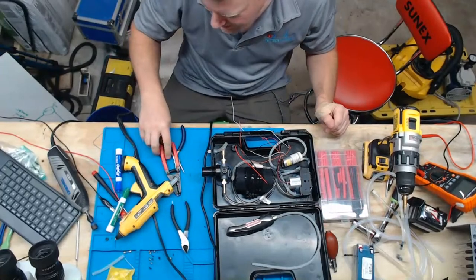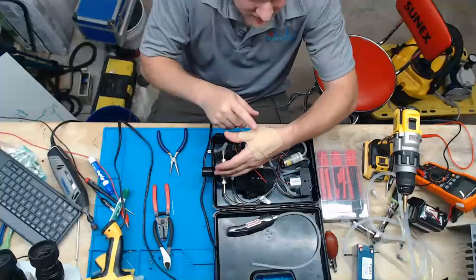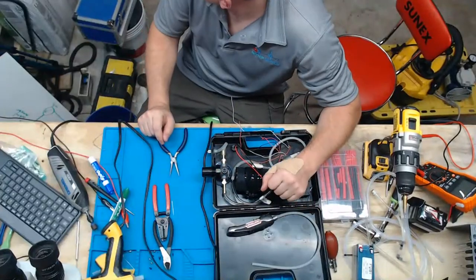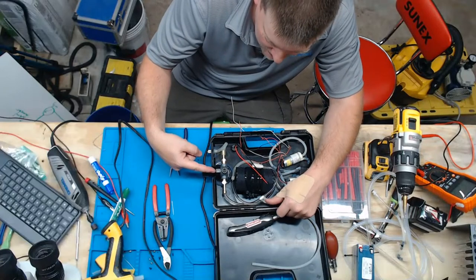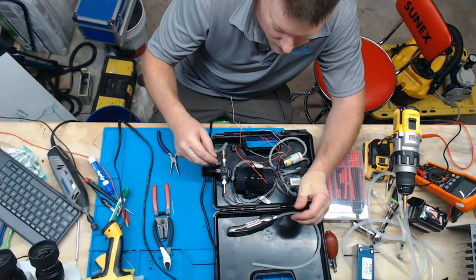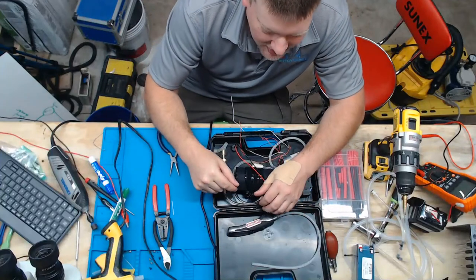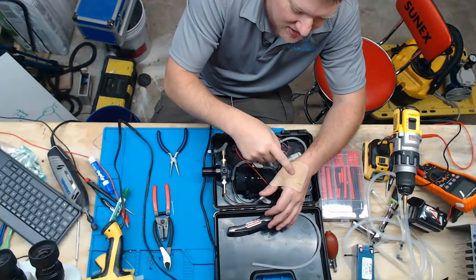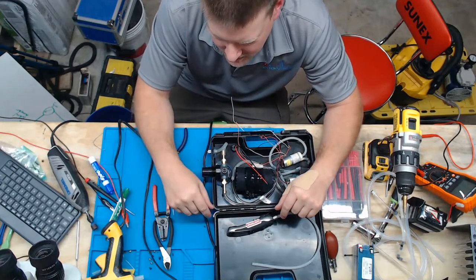All right. So that's enough talking, guys. I have been working. I was using a very large stepper drill bit, and I was cutting the hole in the side here. And the bit actually went all the way in the case and it wasn't coming back out. And when I pulled it out, it just skidded up my wrist a little bit. And, you know, stupid stuff. It is what it is.